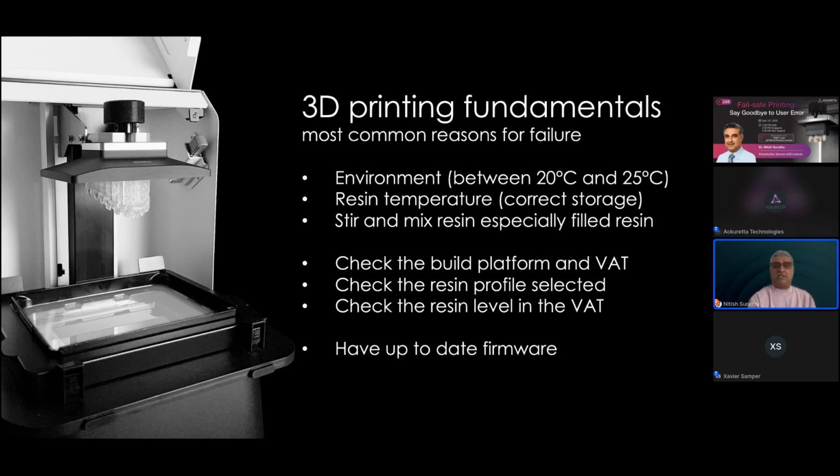Alpha AI Premium is now up to 5.0.3. Make sure you've got the latest version of the software. Sometimes software updates can have glitches. That's not too often though, because companies do test their software updates. If you want to wait a bit before you update, that's fine. That's your prerogative. But usually I like to keep firmware and software absolutely up to date.